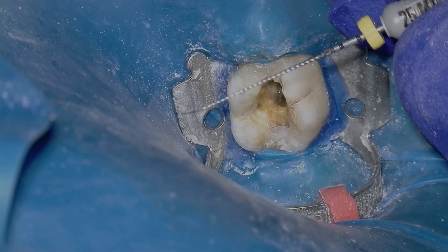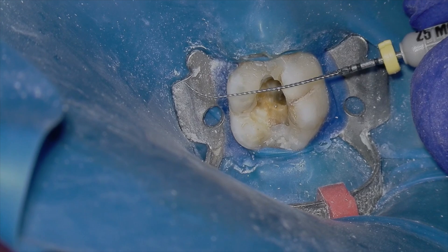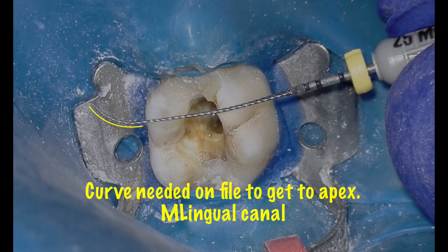You know that feeling when you're taking your endo file, trying to go to the apex, and it just hits one of those boom boom boom and does not want to go? It's so frustrating. Let me show you one way to get around that. Here's my #8 file — this is a case from last week.